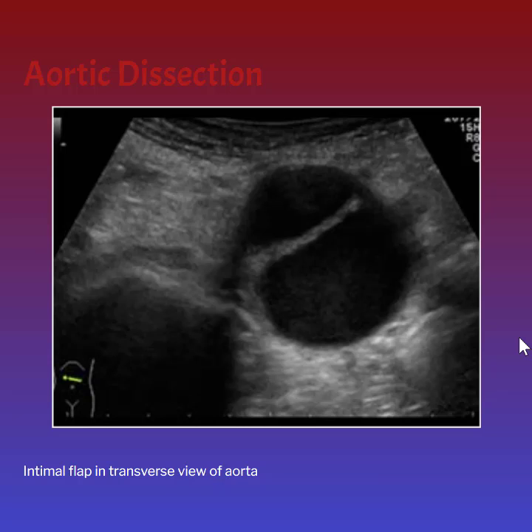This is a still image showing the intima within the lumen. Again, we want to make sure that we are not mistaking artifacts within the lumen as intimal tears. We should be able to see this in two planes.